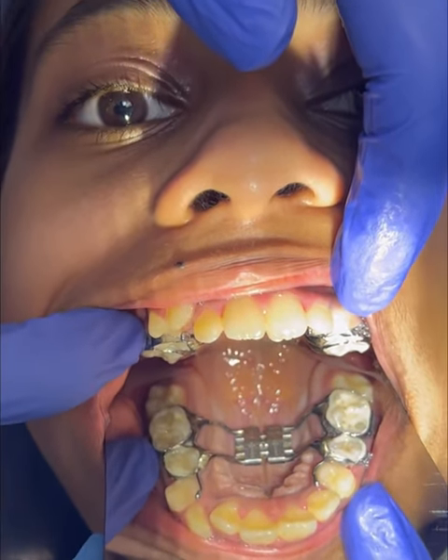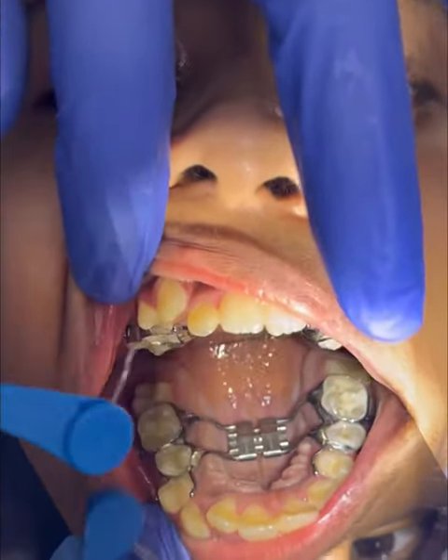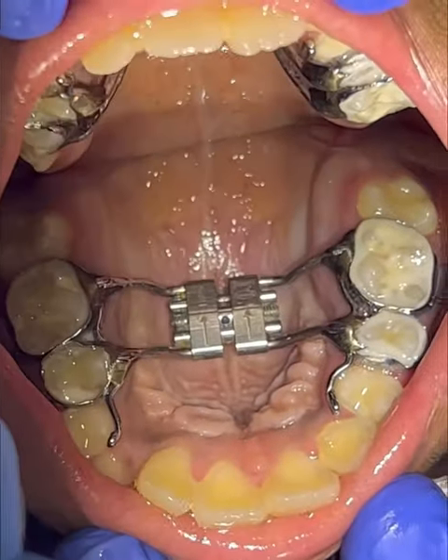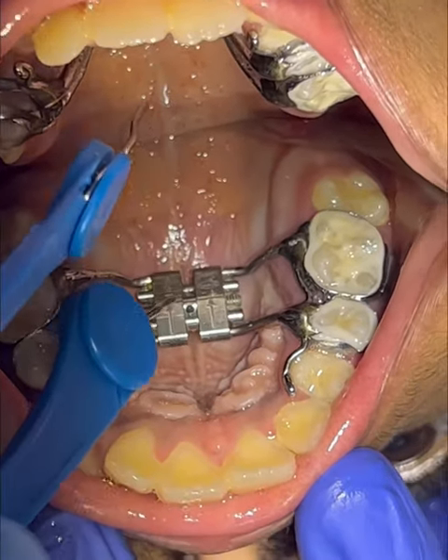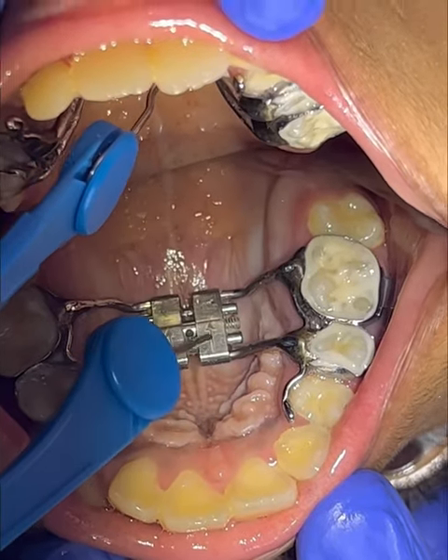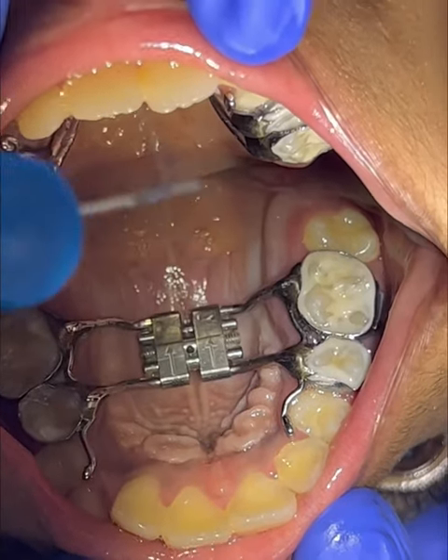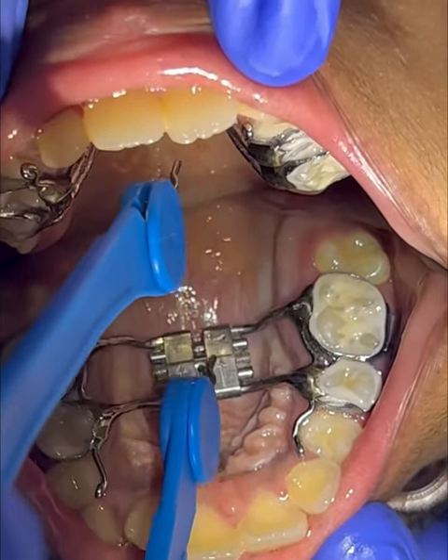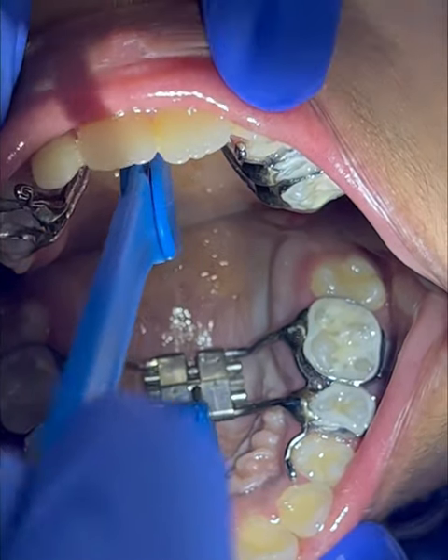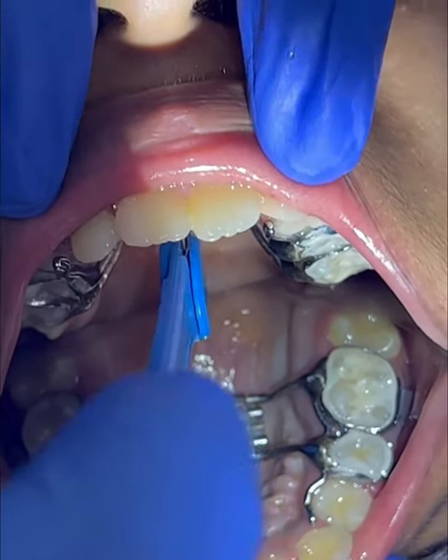In Rapid Maxillary Expansion, expansion is carried out every day using a special screw. There is a hole in the expander screw and an arrow indicating direction — expansion should be carried out towards the arrow, meaning towards the back side. This is the key normally recommended during expansion; parents at home can easily place the key into the hole in the patient's expander and carry out expansion very easily.